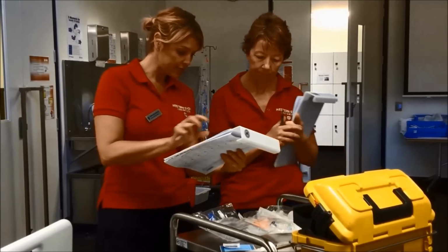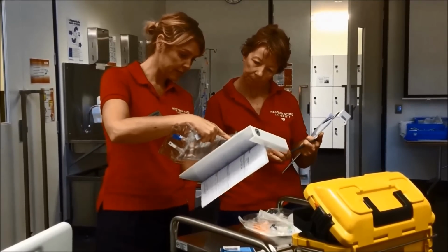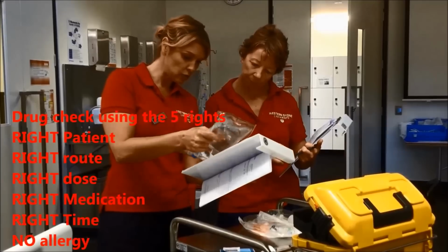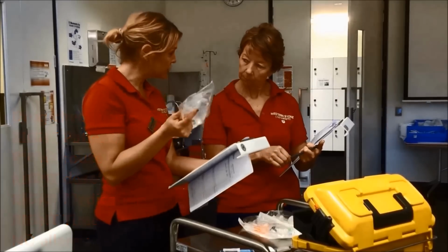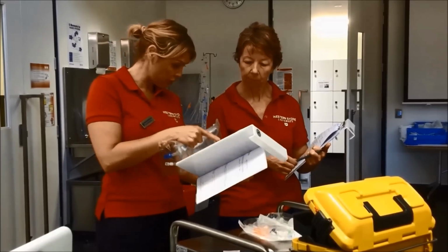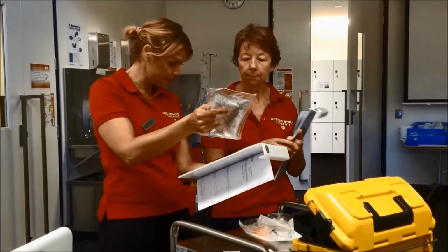And then I also have this normal saline, 500 mils. Same biodata, 895-689, 1st of 3rd, 45. He has no known allergies. Today's date, normal saline or sodium chloride, same product, 500 mils. Once I've given my gentamicin in the 100 mils over the hour, I'll be running it at 4th hourly rate. Signed and printed by the doctor, hasn't been given, it's IV, expiry date's 2018.